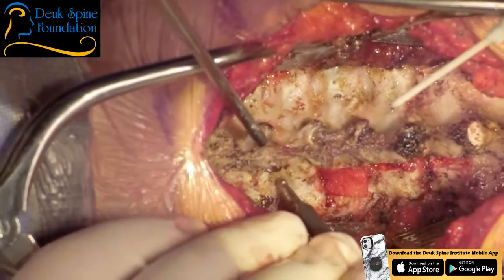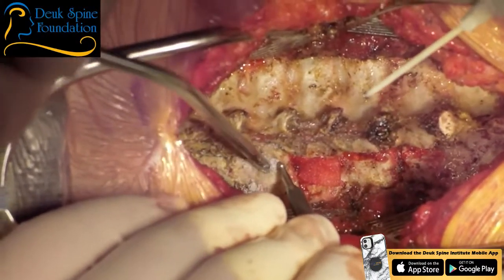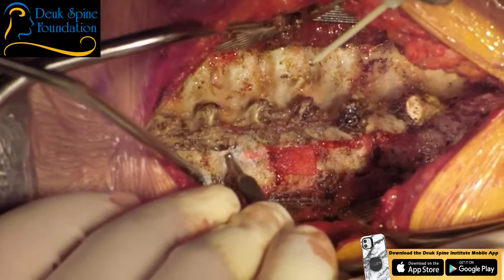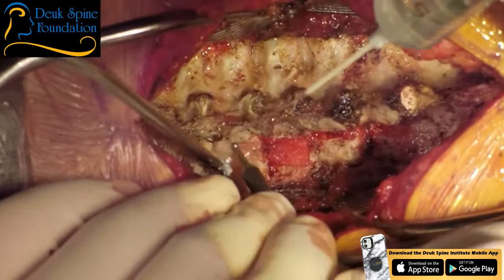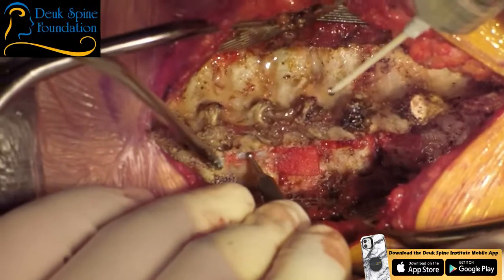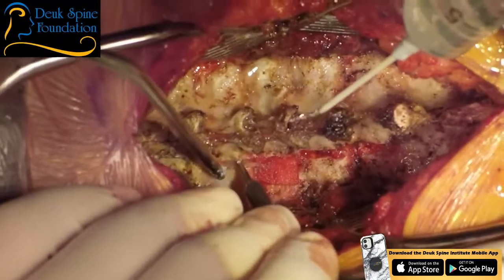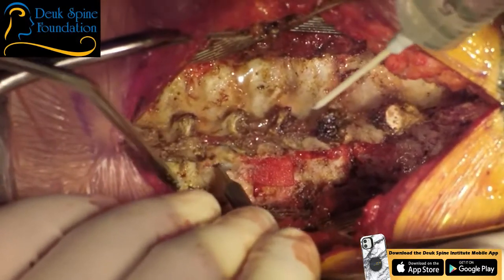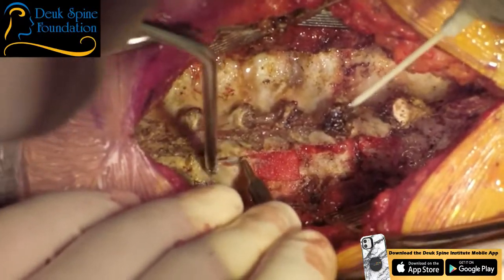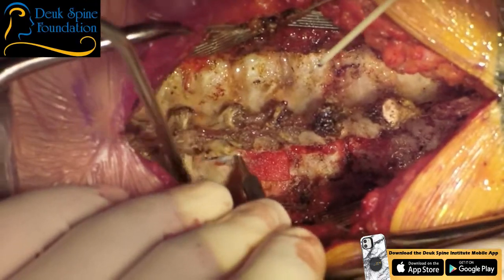This will be four. Oh, by the way, as you go further up, the lamina gets thinner, so you want to pay attention to that. You want to modulate the depth of your drill. As you get up to number three and four, it's very thin. Okay. There's the dura. I have a little piece here that's still connected. You never want to push down.